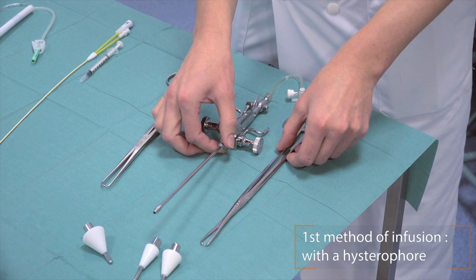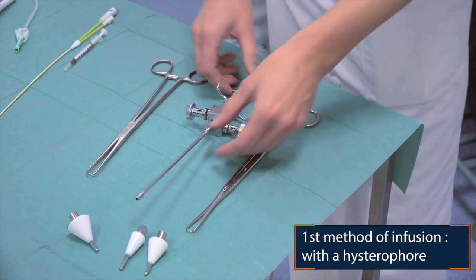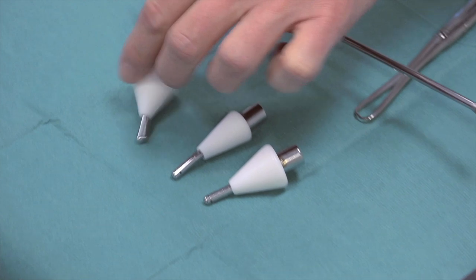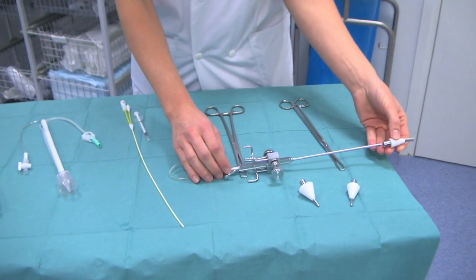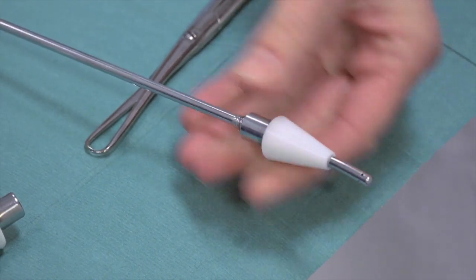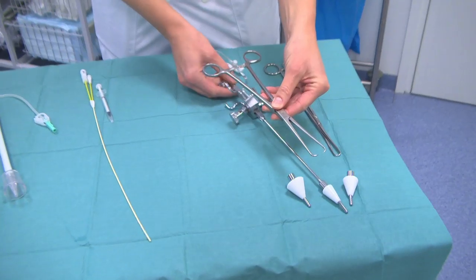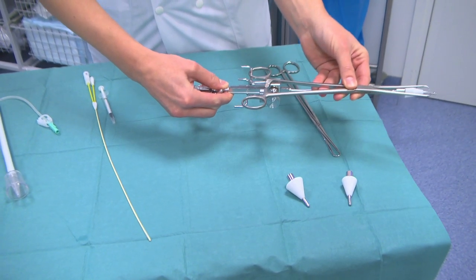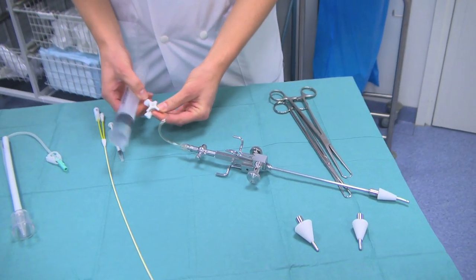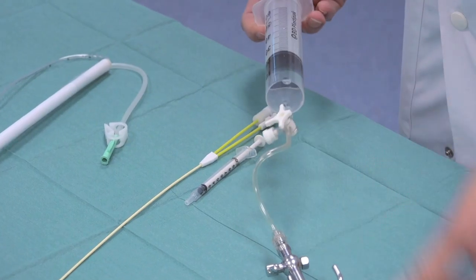The first method of infusing the contrast media is with the hysterophore. It's the oldest method of infusion of the contrast media. You can use three different tips at the hysterophore. You put it on the cervix, then you attach the hysterophore to stabilize it on the cervix. Then you can start with infusion of the contrast media into the uterus.